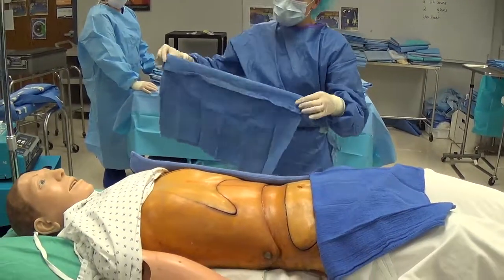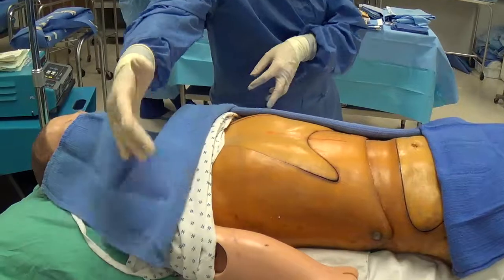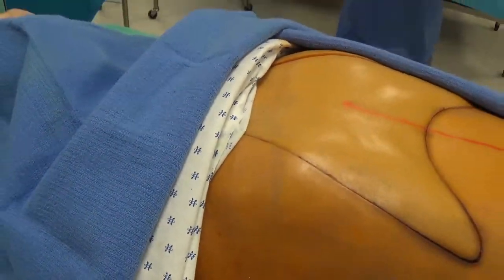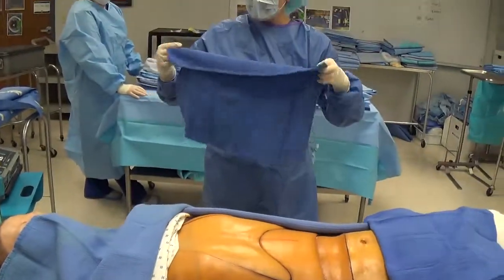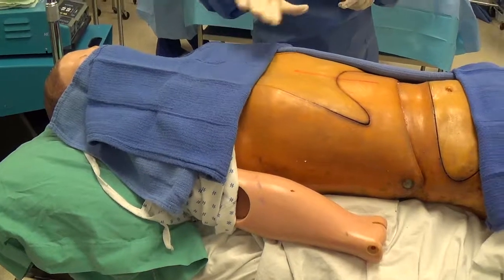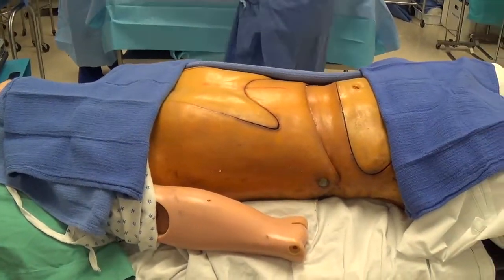If you accidentally placed your towel too far out and the patient's linen is showing, just grab another towel, open it up, make that fold away from you, swing out, and place that towel so you isolate that area and it's not showing on the incisional area.